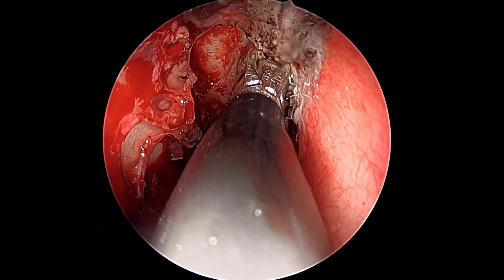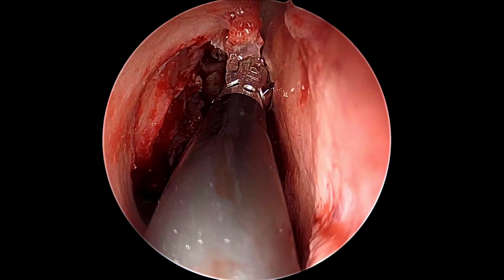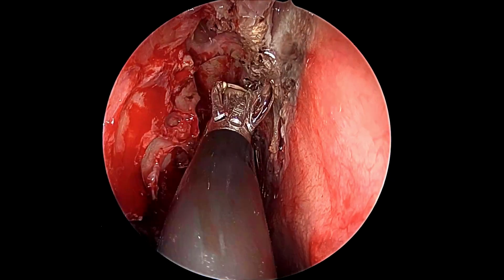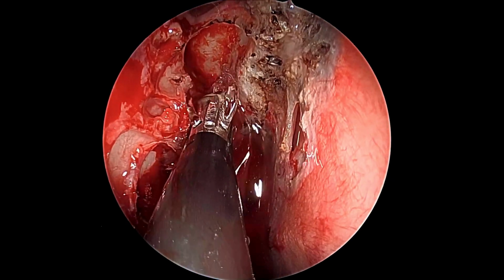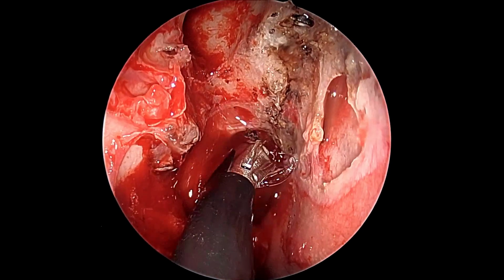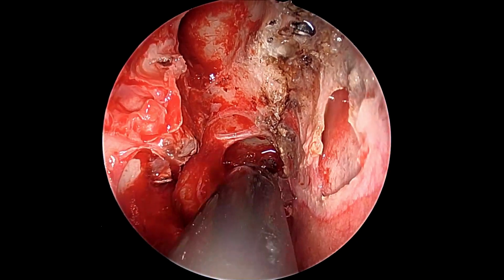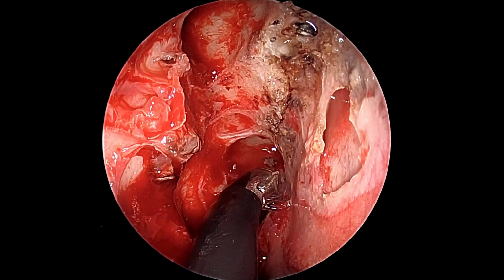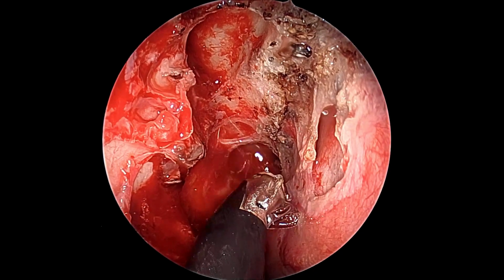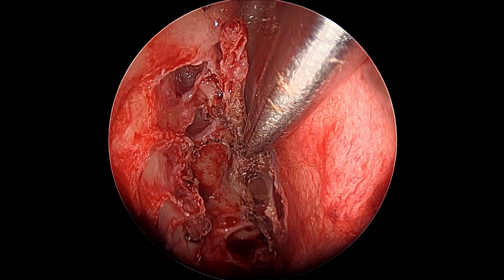The bone is flat, the mucosa has been devitalized along the septum and the base of skull. Everything is well visible. The sinuses are open. And one can see here the site of the posterior ethmoidal artery. We need not take it down in this patient. Sometimes even both the ethmoidal arteries have to be taken down.